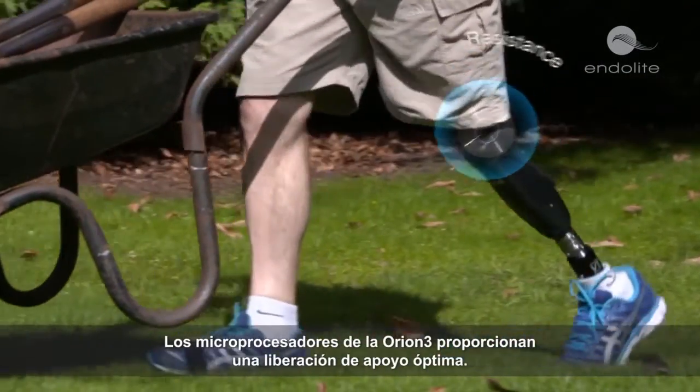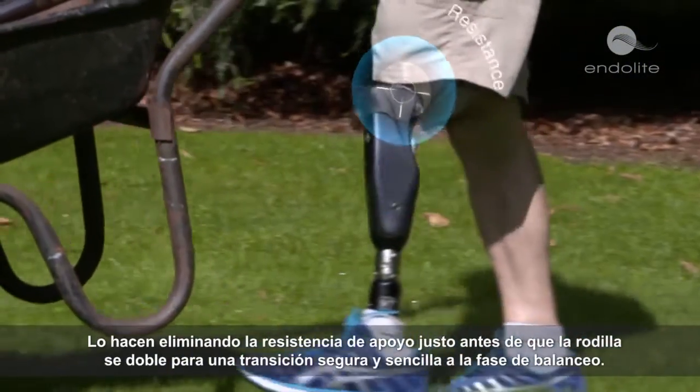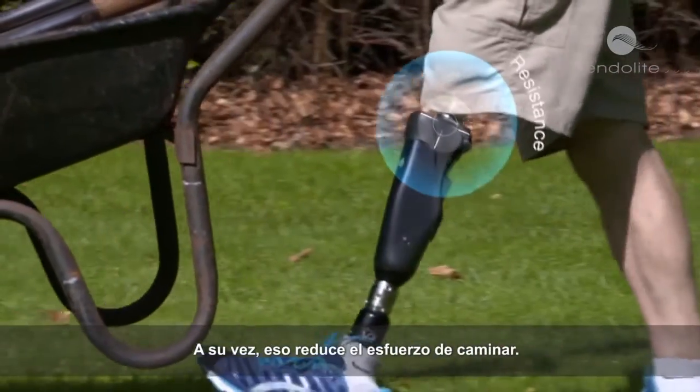Orion 3's microprocessors provide optimal stance release by removing supportive resistance just before the knee bends, for a safe and easy transition to swing phase, which in turn reduces walking effort.